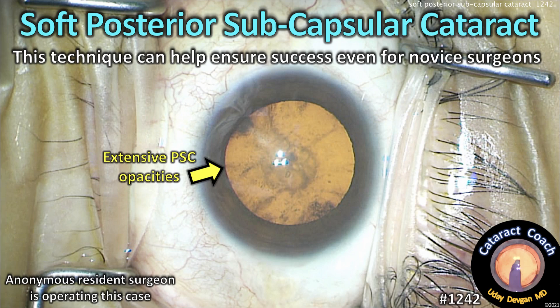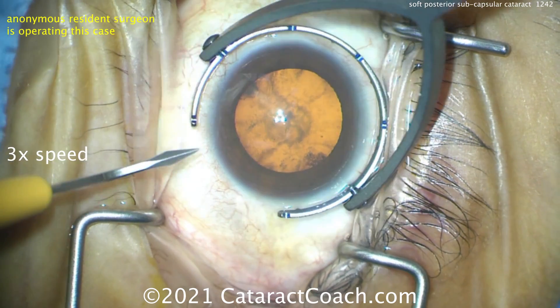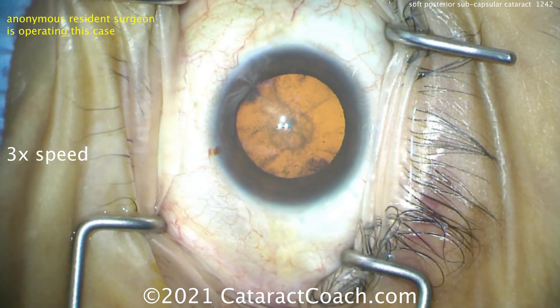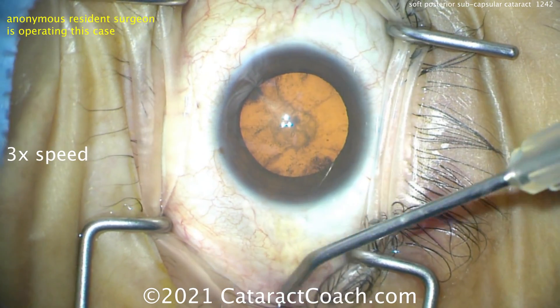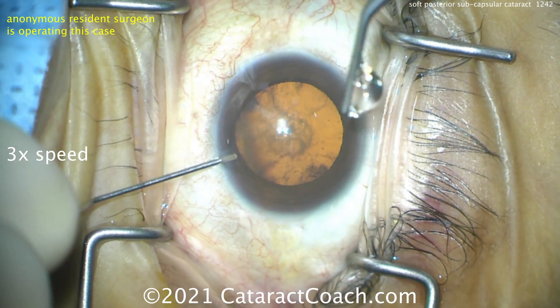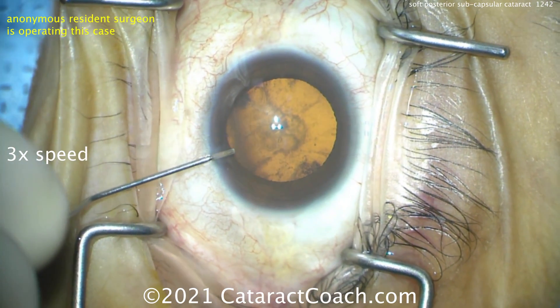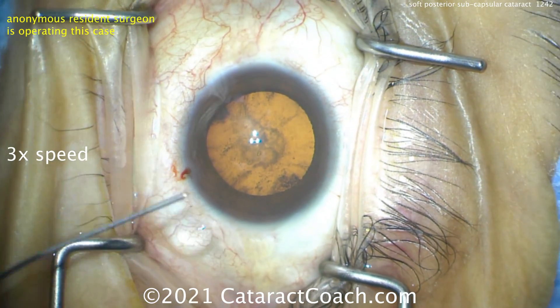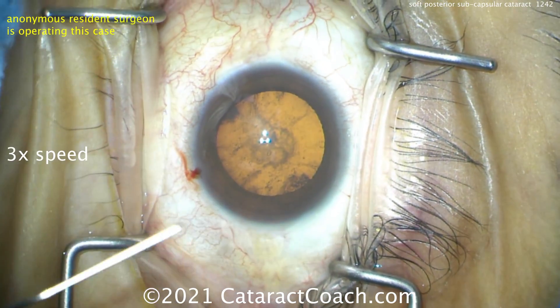cataractcoach.com — soft posterior subcapsular cataract. This technique can help ensure success even for a novice surgeon. An anonymous resident is operating at three times normal speed so we can watch the whole video. There's the paracentesis. This cataract is all posterior subcapsular, right there in the center. The resident is putting in some anesthetic inside the eye. The patient also received a retrobulbar injection. You can see good draping of the lashes here.